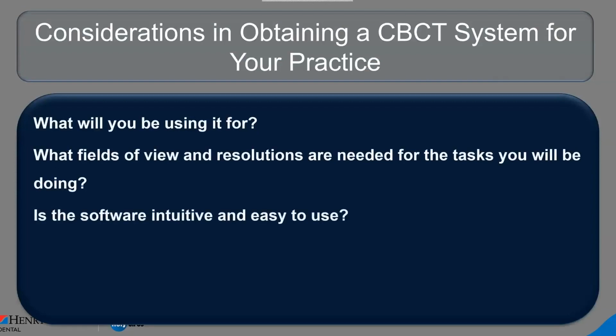Is the software intuitive and easy to use? And this one is very important. We want to make sure that you feel very comfortable with the software, that it's easy for you. And we do help to make sure that this is as easy a process as possible. Many of you have probably already played with the software. If not, see if you can get a software demo. I think this is one of the areas you definitely want to feel comfortable with. Sometimes we have doctors that will come into some of our courses and they'll say, hey, I purchased a machine maybe 5 years ago, and I never used it because I couldn't figure out the software. Well, you don't want that to be you. Definitely play with the software. Make sure you feel comfortable with it.